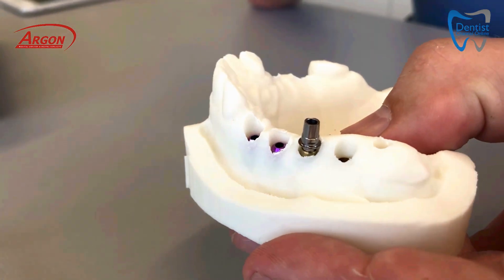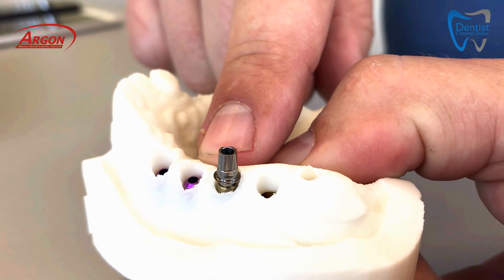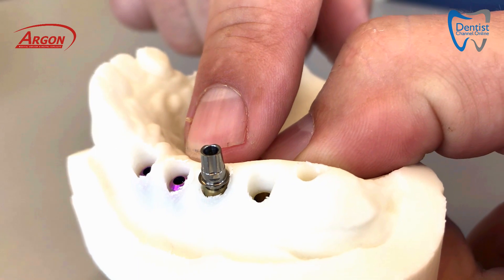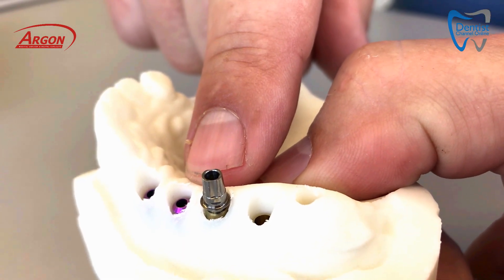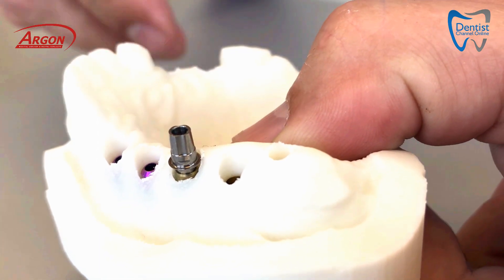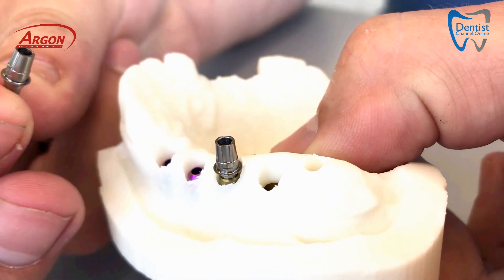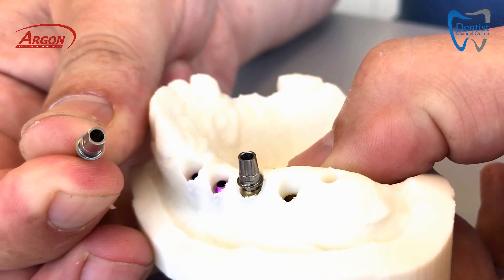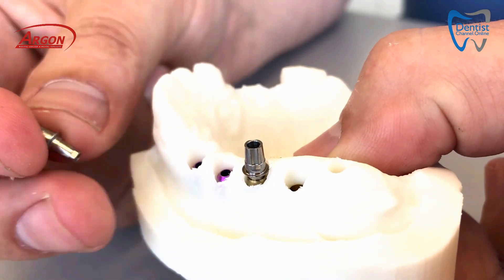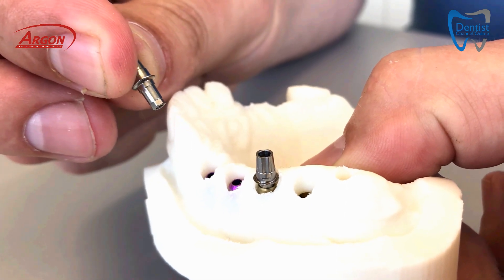As you can see here, I have already placed the so-called EAK abutment on the implant. You can use this abutment-level impression technique with the EAK abutment, but also with the temporary abutment, which is similar. The difference is that the temporary abutment is not sitting in the cold-welded conical connection.